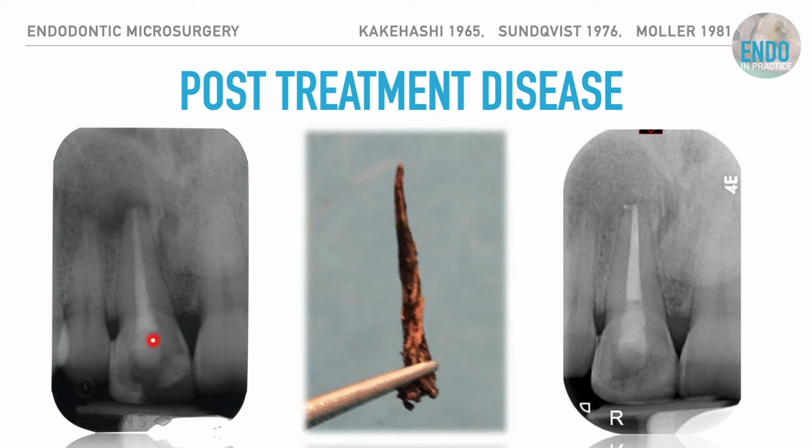So if I was looking at the radiograph critically, I'd say, well, okay, the coronal restoration isn't subcrestal, and the obturation looks good and it's well compacted all the way to the apex. But when we've got more and more systems going to a single file and single master GP cone, that all adds up to making post-op radiographs look good, but it gives you no idea about the level of decontamination of your root canal system. So, that's the result. A year later, endodontic retreatment, the lesion healed, and we had a successful outcome.